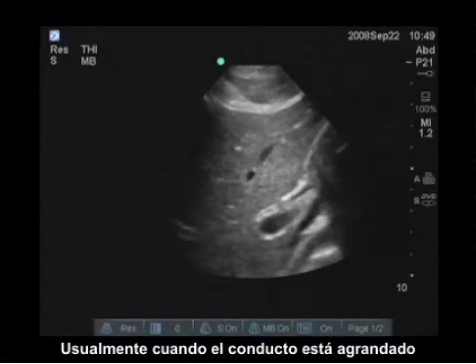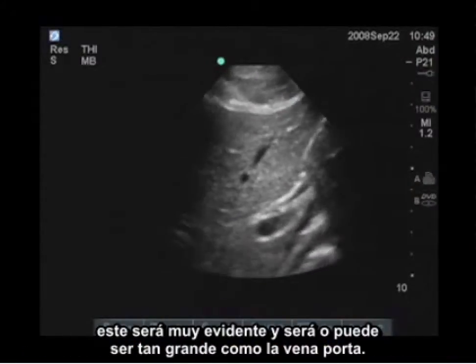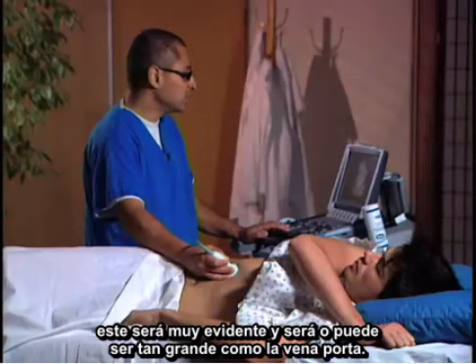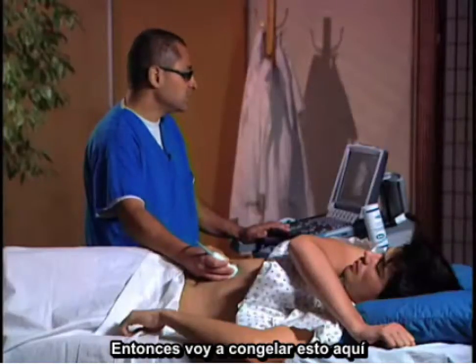Usually when the duct is enlarged, it'll be quite evident and it can be as large as the portal vein itself. So I'm going to freeze this here.